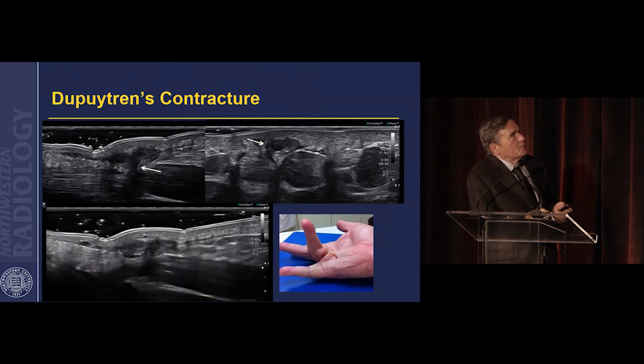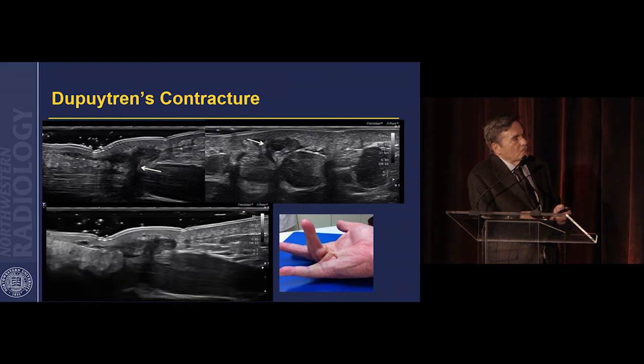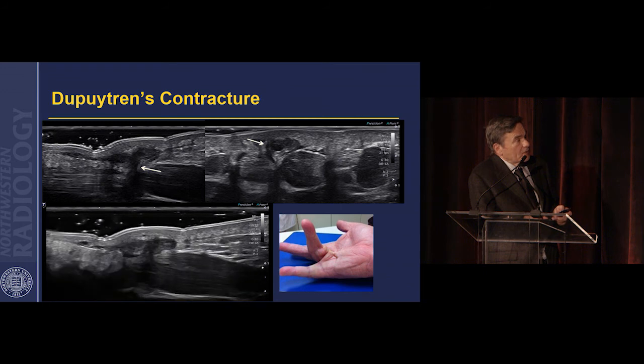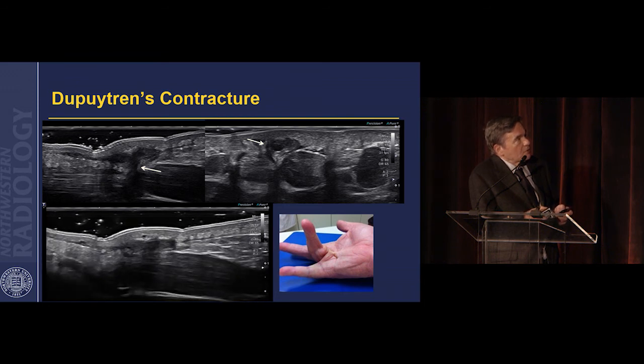This is a Dupuytren's lesion or contracture, and these are not uncommon in Northern Europe, but they are also seen in diabetics and alcoholics, and usually it involves the fourth and fifth fingers, where in the extreme form you get a flexure contracture, and there's a fibroproliferative cord of tissue that develops. These are very difficult to treat, and I think the reason is that if you look here, instead of being a superficial location, it's actually infiltrating the tendon sheath, making it really difficult to treat. And here on the transverse image, we can see some compression on the lumbrical muscle as well.